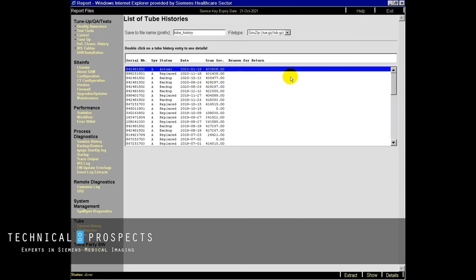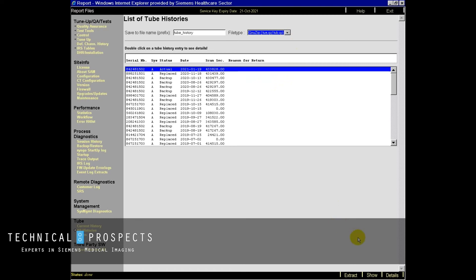So now we want to save our file. File type, we'll leave it here as a zip. We're going to go to extract. So now the file has been saved in our C drive. And to access file, we'll just go back to our C drive to access that file and save it.